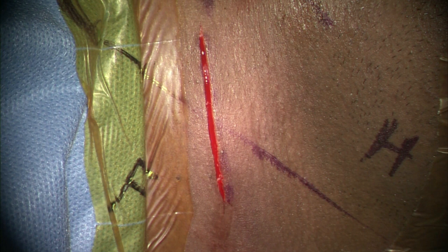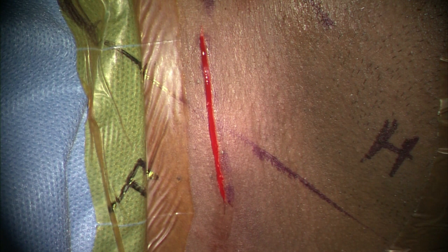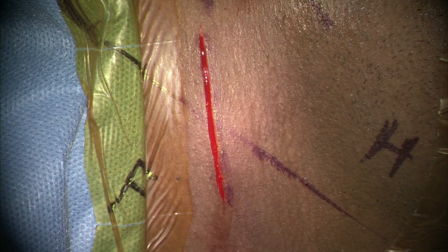This 12 minute video will demonstrate the anterior cervical discectomy and fusion surgery in a stepwise fashion. The patient has been positioned and draped appropriately. On the right side is the head end marked by H, while F denotes the foot end.